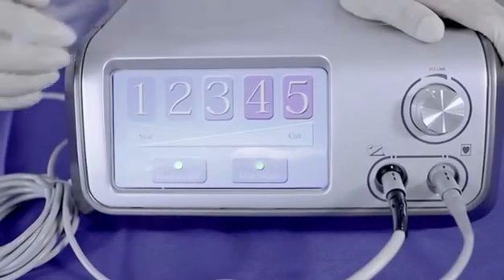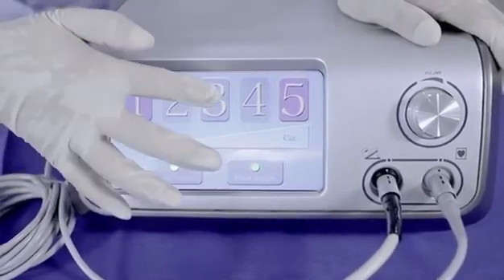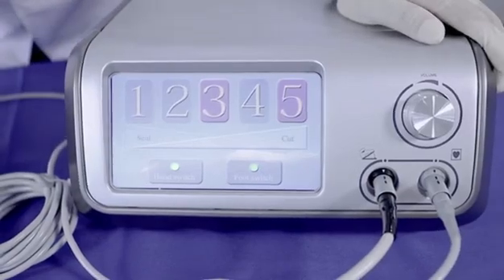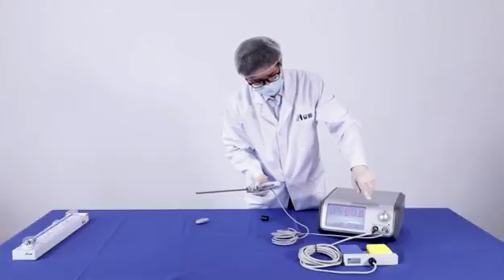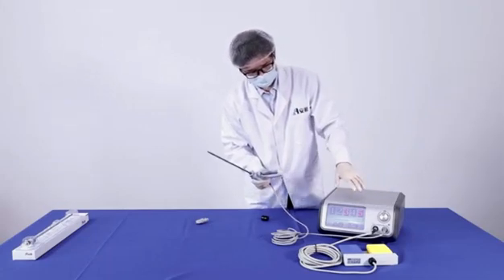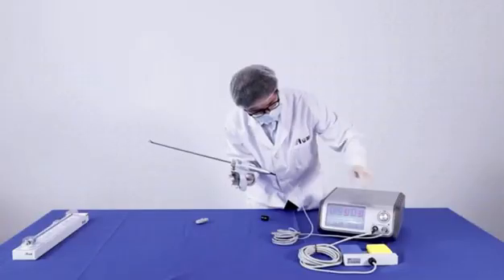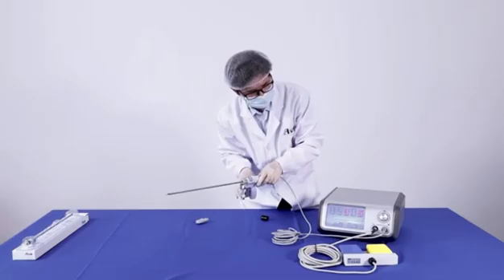Output power can be selected from power level 1 to 5. The maximum power level setting is always 5. The minimum power level can be selected from 1 to 4. The system defaults to minimum power level 3. When this power level is activated, the audio feedback is initiated and the corresponding level is shown running on the screen.